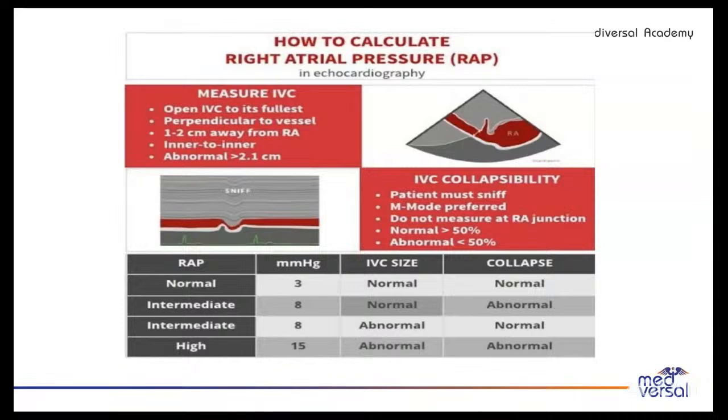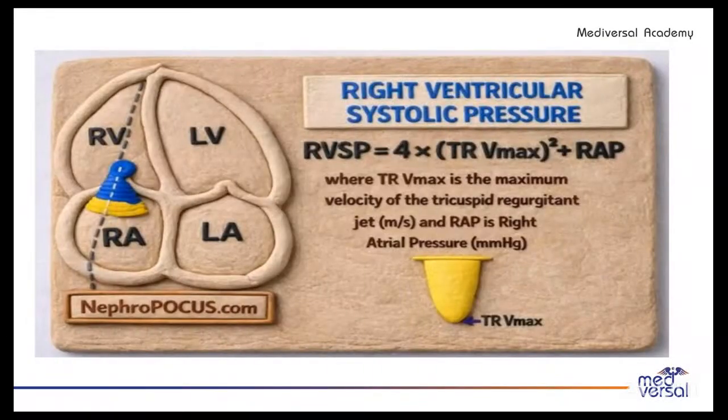In cardiology, we assess IVC to increase or decrease the dose of diuretics in heart failure, based upon IVC size and fluid overload status, either oral or IV, to escalate the dose of diuretics. After IVC measurement, we generally proceed to right ventricular systolic pressure measurement.